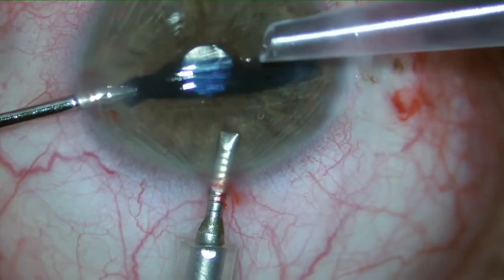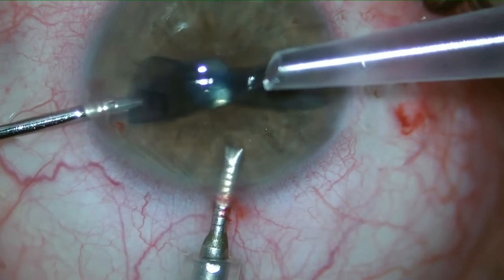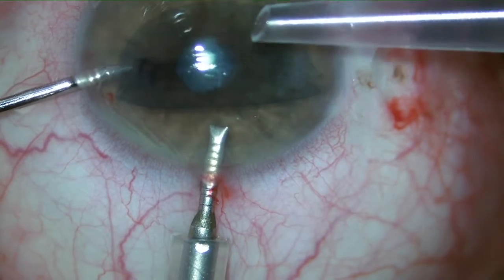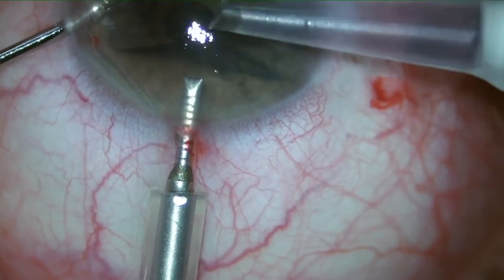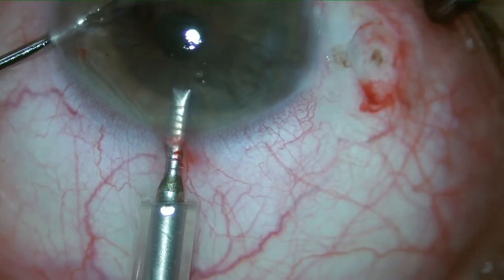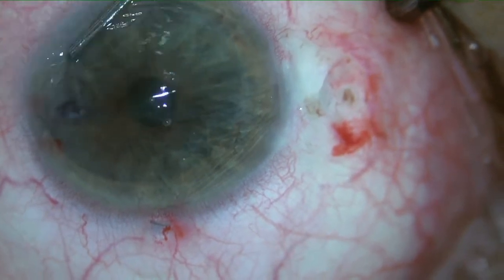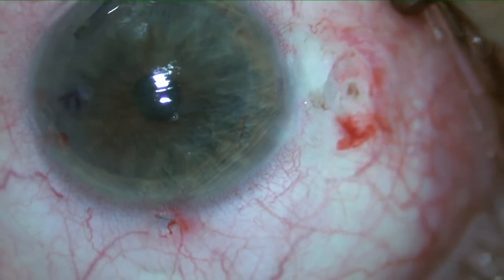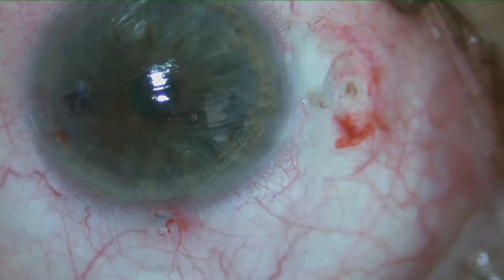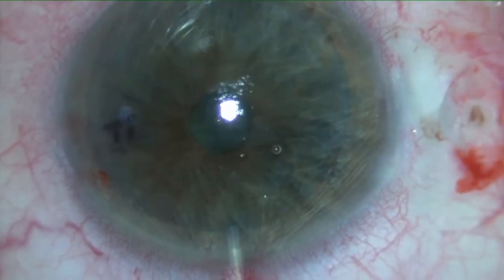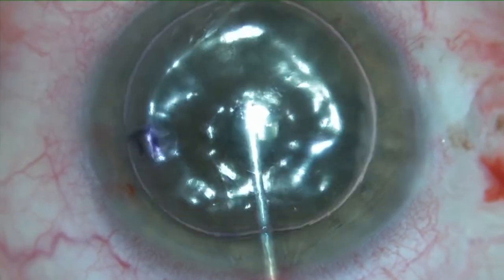While holding the graft with the forceps, unfolding takes place spontaneously and minimal tapping on the cornea is required to complete the maneuver. The graft is centered, acting on the recipient cornea from outside. Finally, air is injected to attach it to the posterior corneal surface in the right position.